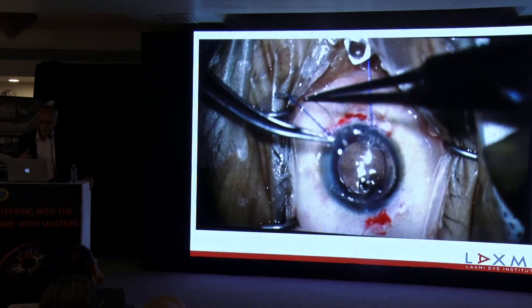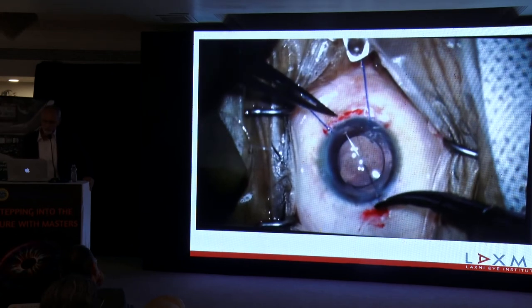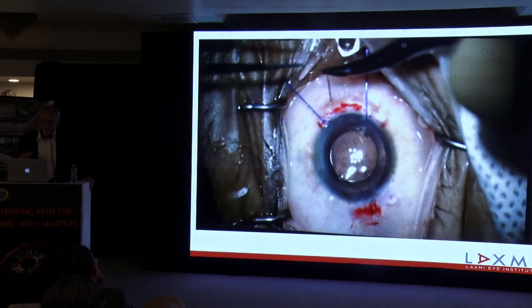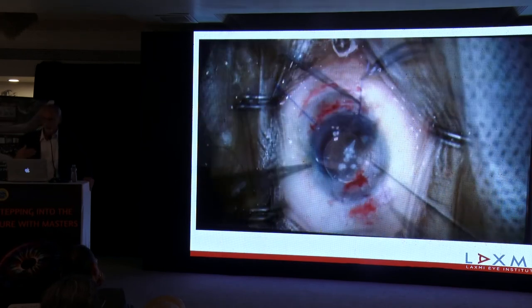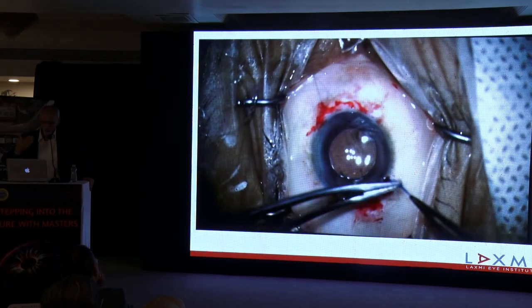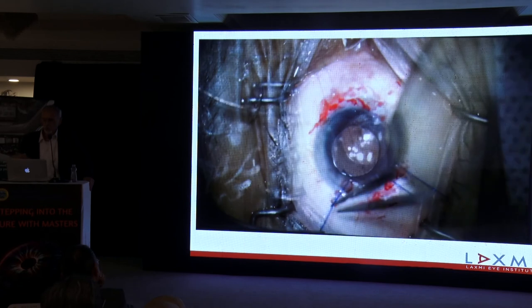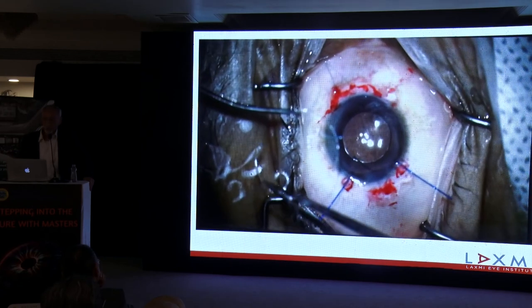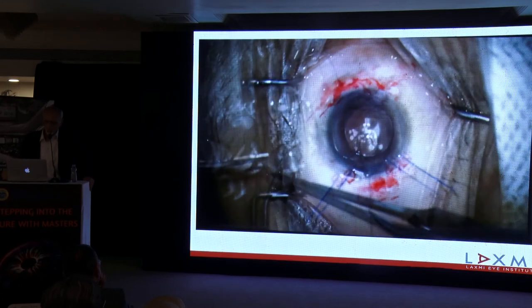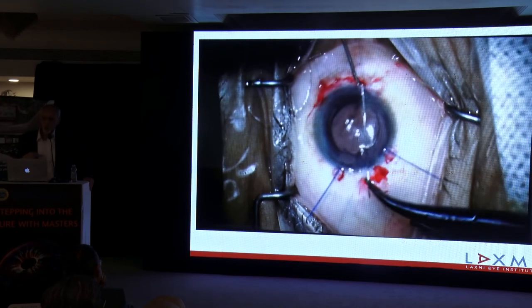A double arm needle was used to thread through one eyelet, and first the two needles were taken out. When you have to go for such an insertion, it is always better to slightly bend the needle so that it's easy to put it. Then I took out those hooks and put them on the opposite side. And the second eyelet was threaded with 9-0 suture on an STC needle. First, the needle was taken out through the opposite side port.